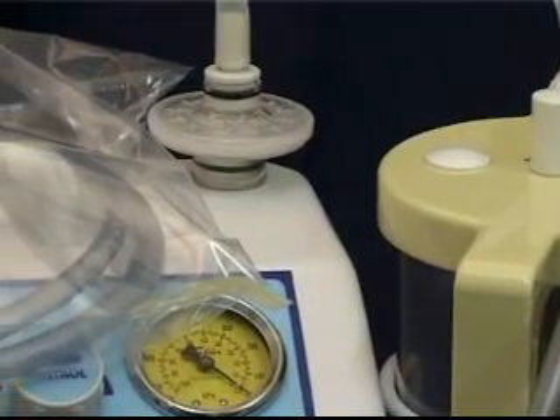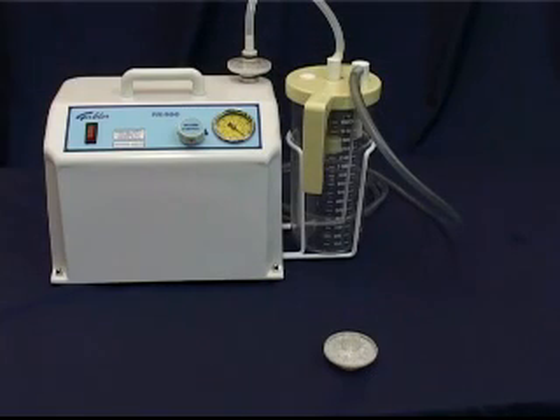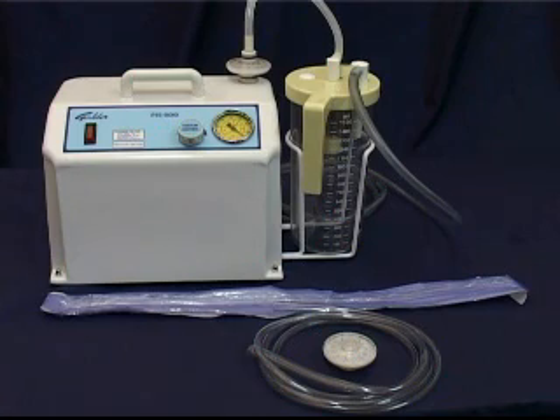The following disposals and parts should be ordered on time and kept in stock: filters, which are also called micro filters, silicon tubing and suction catheters.